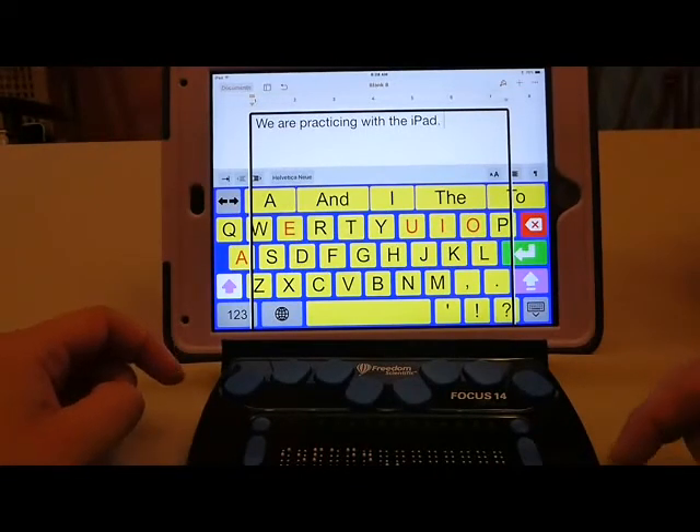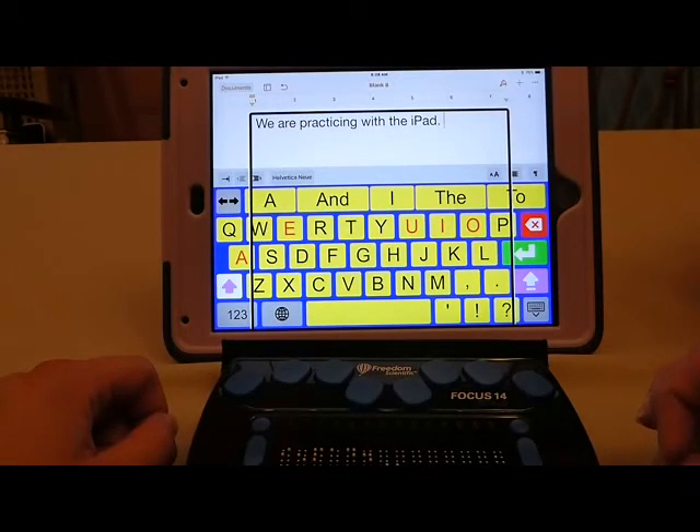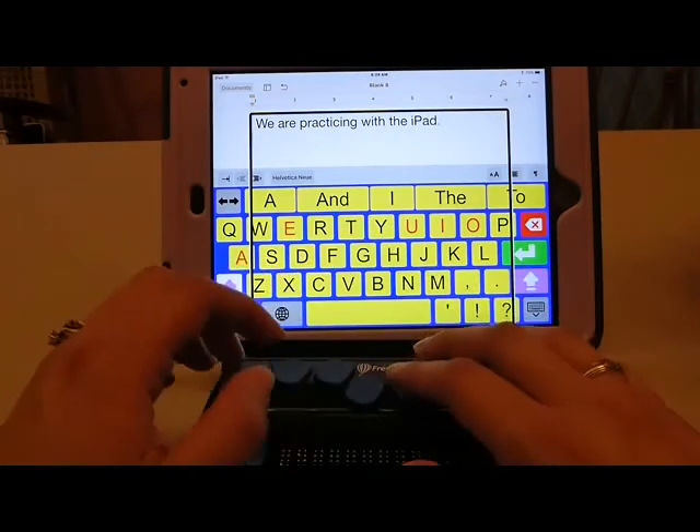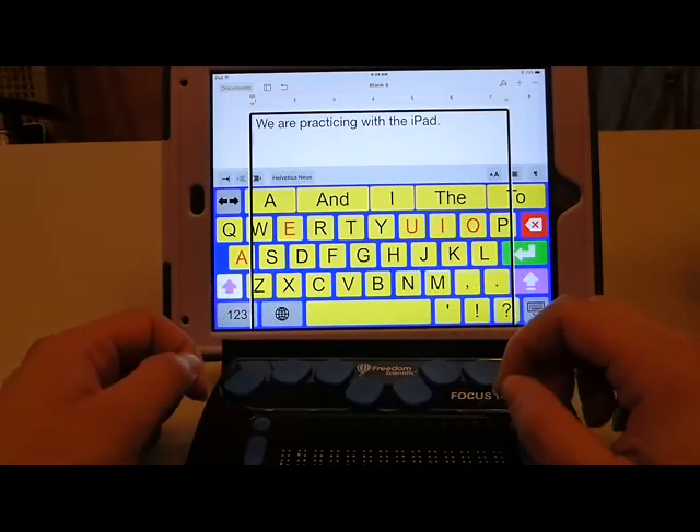So as you can see, I went back and fixed a mistake — I went ahead and deleted the whole word. If I go back and make a correction in the middle of a word once it's translated, it may insert a contraction incorrectly. So it's a good idea to minimize frustration — if you've already had it translate a word, go back and actually backspace through the entire word. I can also do new line with dot 8 and space, and so now I'm on to my next line.